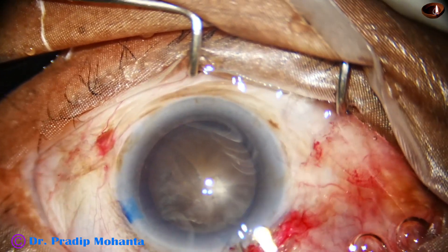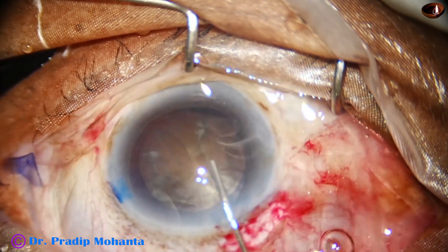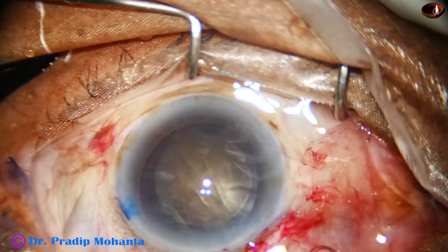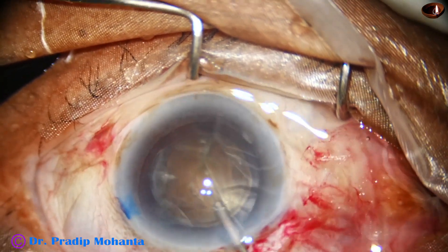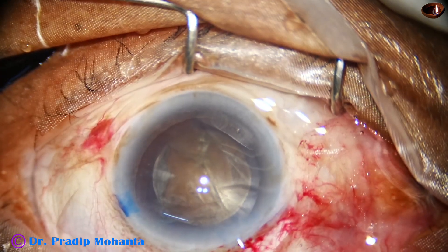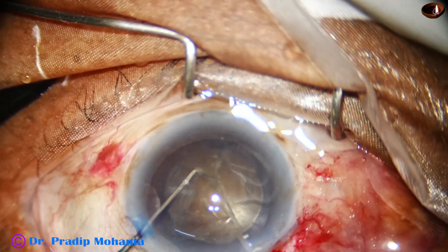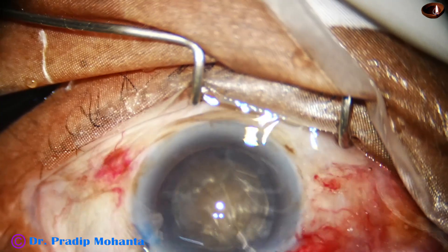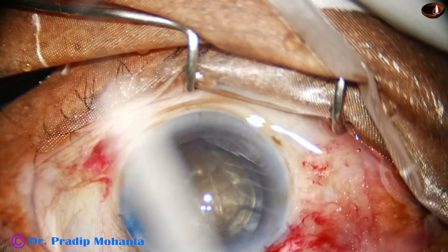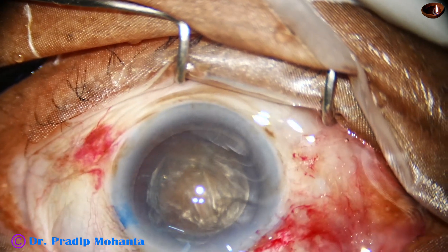Hydrodissection is done at one point, and then tap the nucleus at another point. I know that the nucleus is mobile, but I am going to take two Sinski hooks and rotate the nucleus. This bimanual rotation causes minimal stress on the zonule.